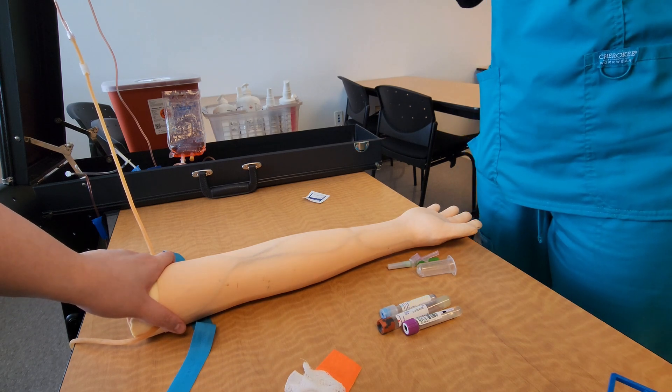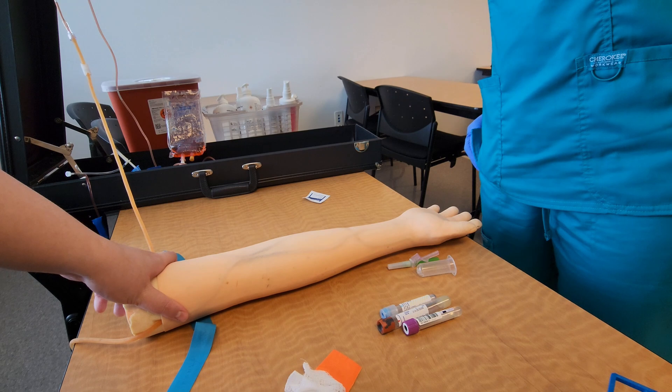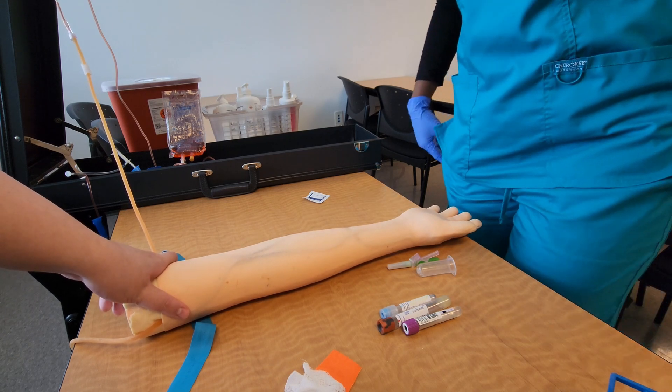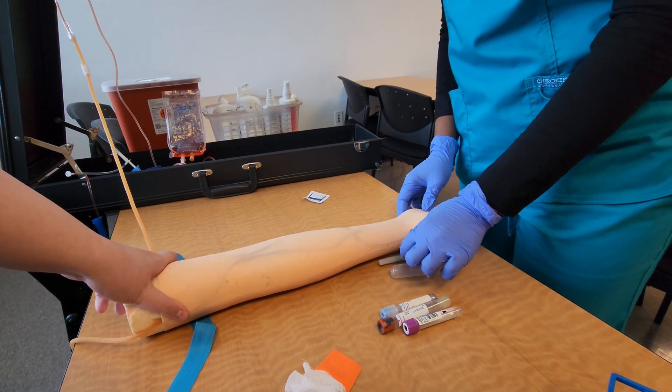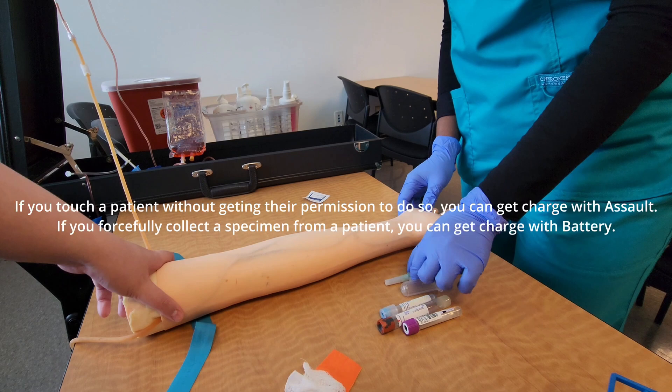The first thing you want to do when you get into the room with a patient is introduce yourself — for example: 'Hello, my name is Latifa, I'm an ABC phlebotomy student, and I'll be drawing your blood today. Is that okay with you?' You want to make sure you ask them if it's okay to go ahead and perform the phlebotomy procedure, because you do not want to touch a patient who refuses — you could be charged with assault.